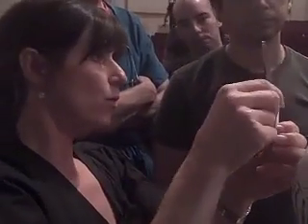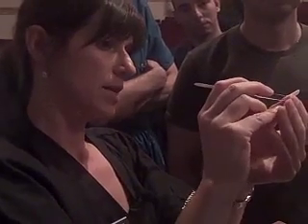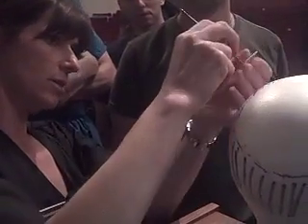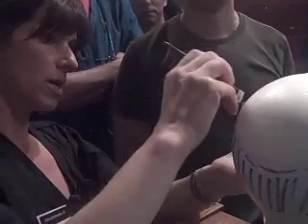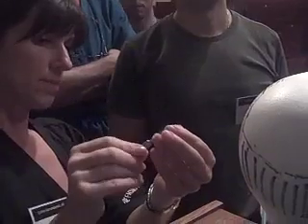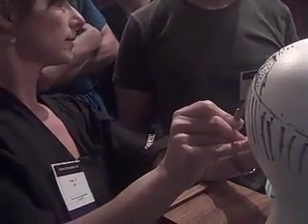And you can have angled forceps, and I couldn't find a clean one while I was preparing for this. You can also come from the side, as long as you're aware where your curl is pointing. You can do the same motion. If I'm placing, for example, in a temple, I'm going to come almost parallel to my graft, always curl pointing to the scalp, and then tuck it in.